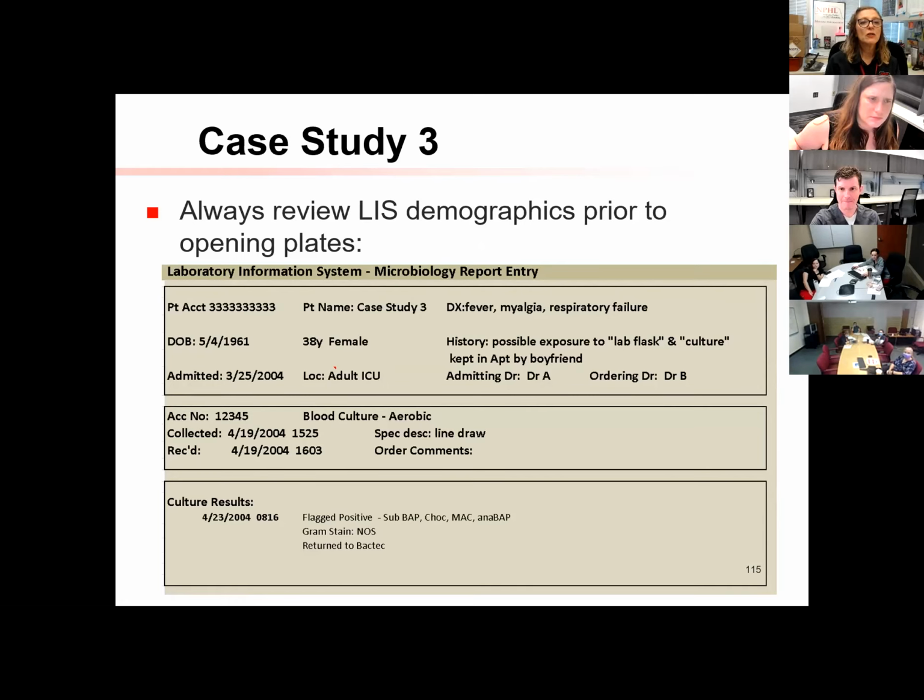I want you to do like we've done with these cases before. My first question to you is look at the requisition. Tell me what the trigger points are. There are going to be some weird ones, but go ahead and type a private message to me and let me know what you think are all the trigger points. Don't mention just one, mention everything that you see.